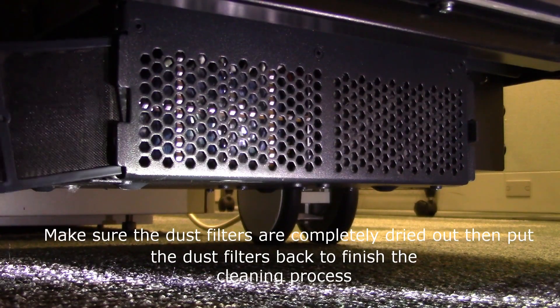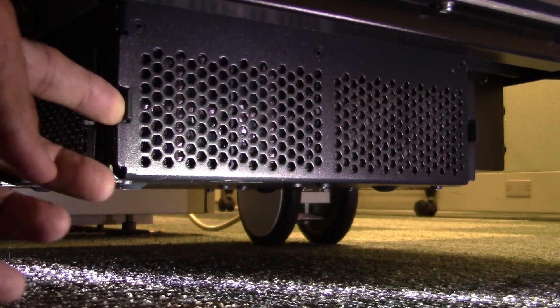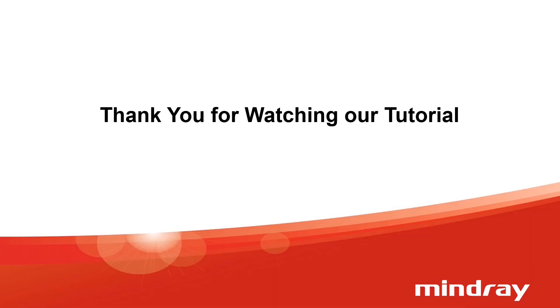Make sure the dust filters are completely dried out, then put the filters back in to finish the cleaning process.